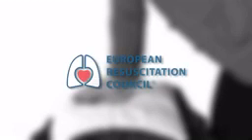First, this film will show you how to perform CPR and use an AED in real time. Afterwards, it will show you the techniques again with an explanation of each skill.